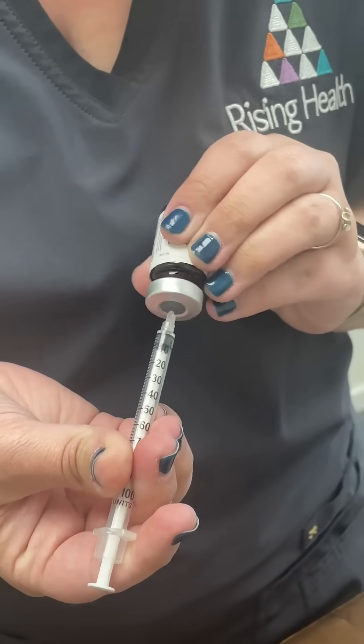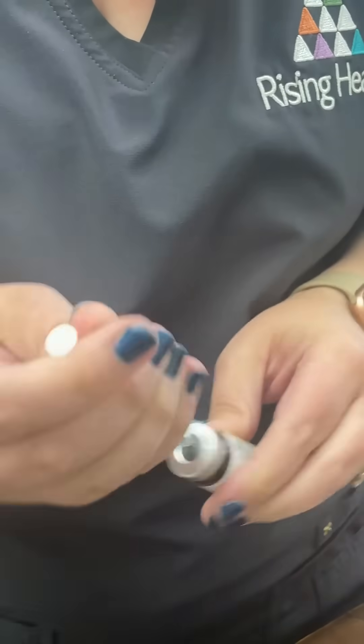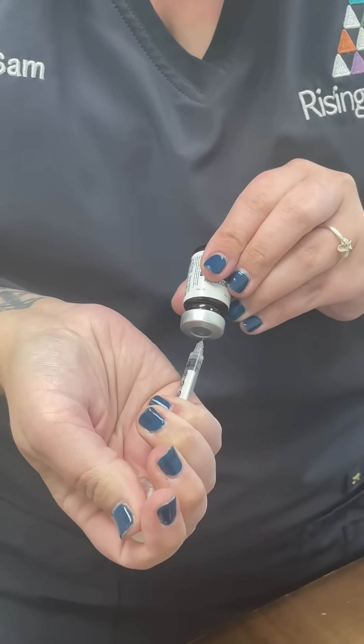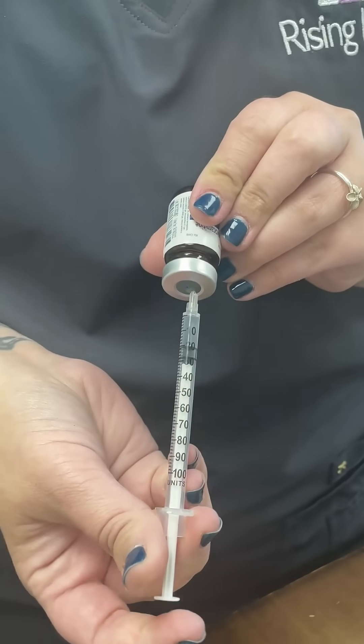If you're having trouble drawing up and you're getting air, you'll just want to get some air into the syringe and push it in, and then you should have an easier time drawing up.